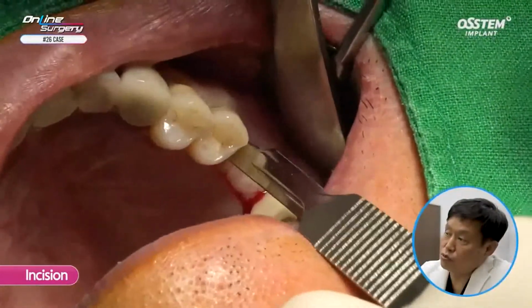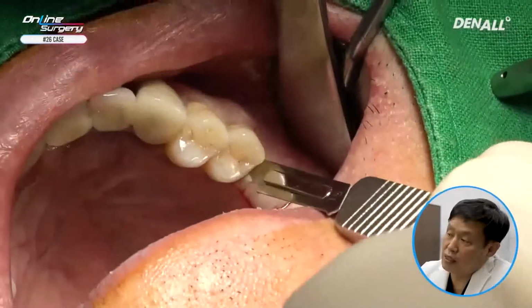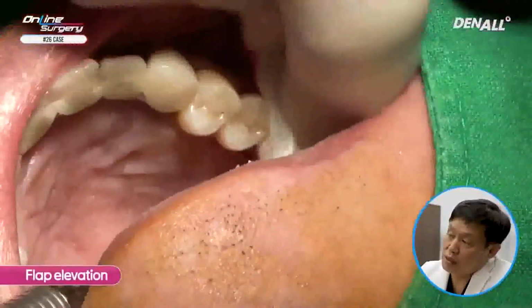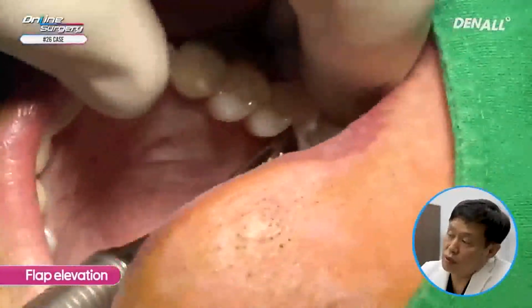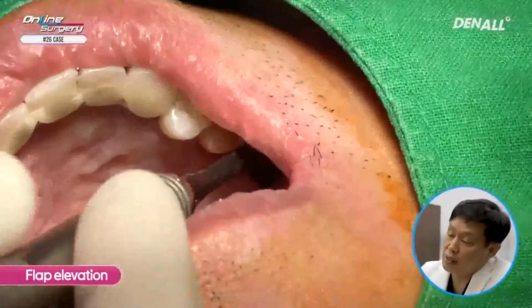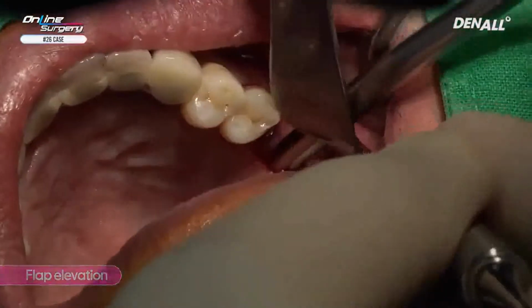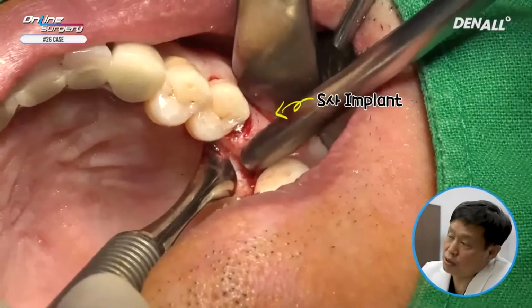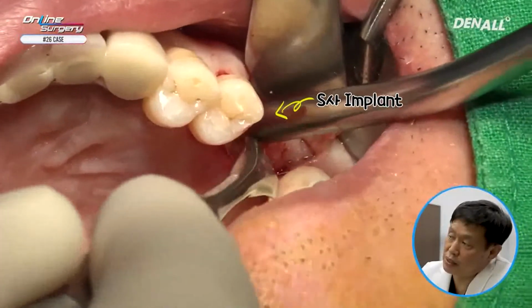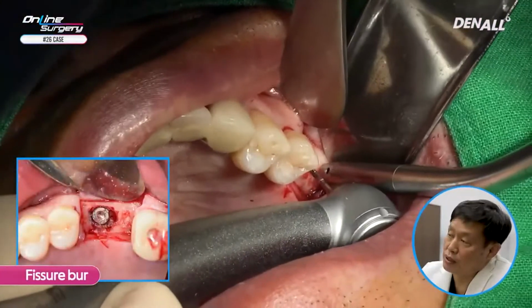It's been a week since the implant was fractured. More so than expected, gingival healing was achieved. On the palatal side, I'm going to make a paracrestal incision and reflect the flap to check the implant position. Once I've elevated the flap, you can see the superior component of the implant which was fractured.